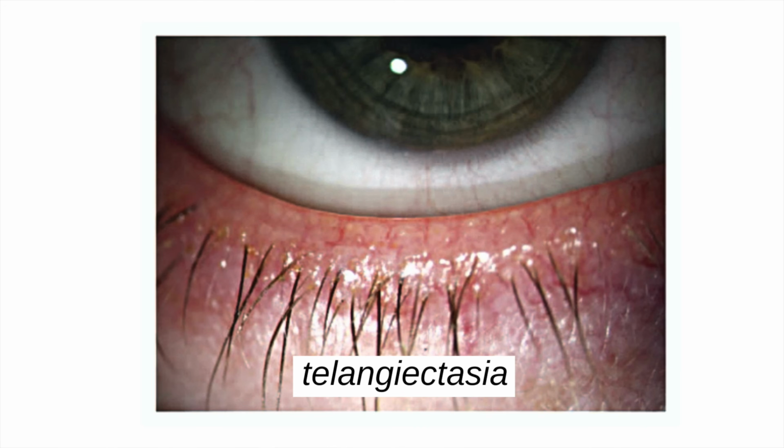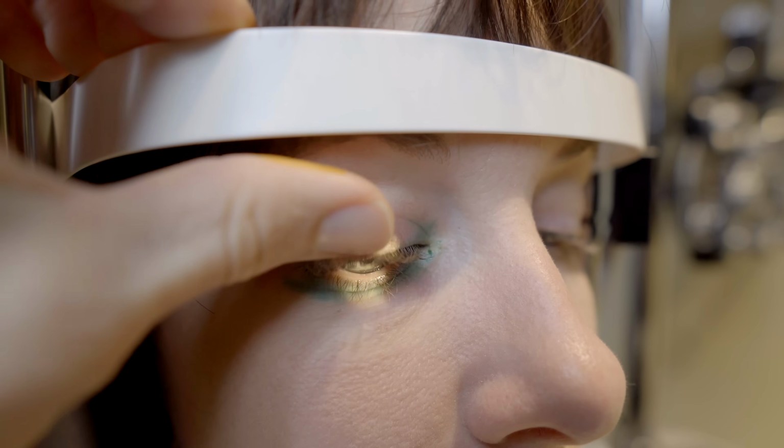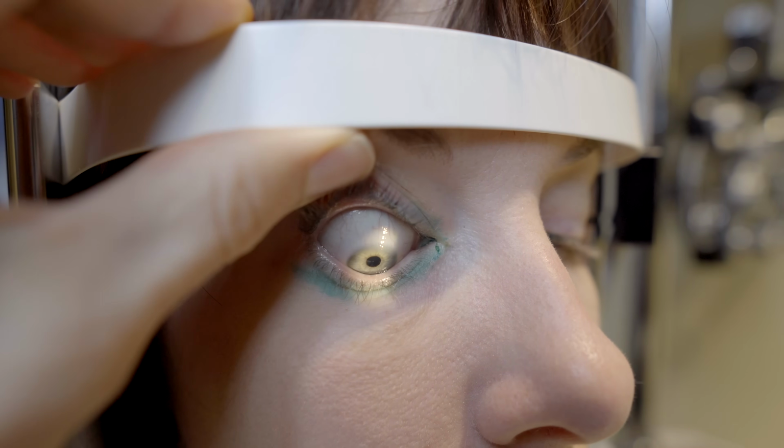And outside of expressing these glands, we're also noting any presence of spider veins on the eyelids, which we call telangiectasia, as this is more of a marker that there's been prolonged inflammation of the eyelids, and somebody may have potentially ocular rosacea. But your doctor is also going to take note of how the eyelids are coming together. Are they actually coming together all the way when they're closing, or are they only, again, partially blinking?